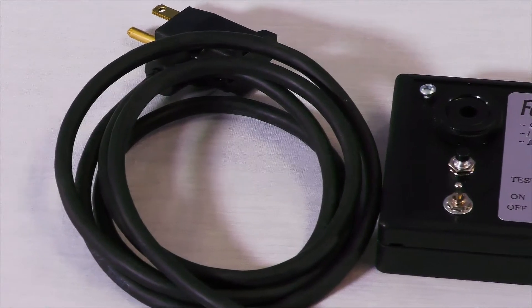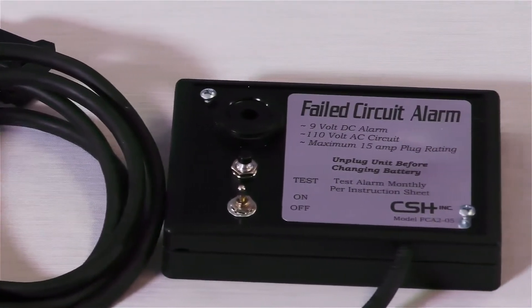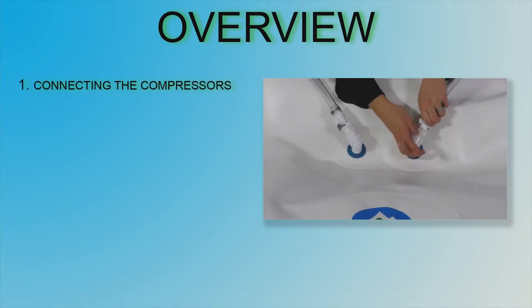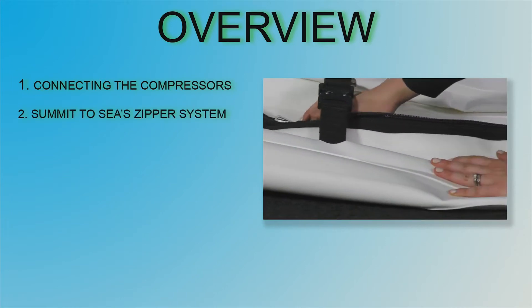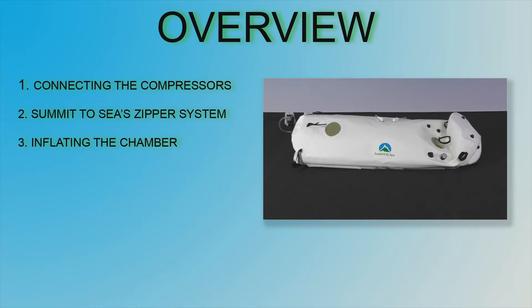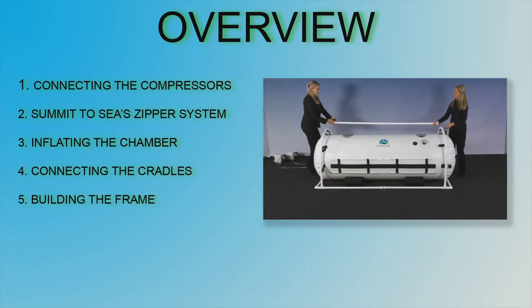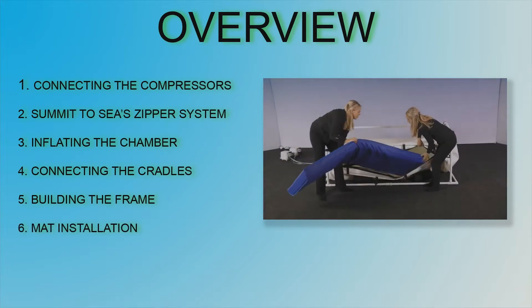The failed circuit alarm is to alert you in the event of a power outage. To give you an overview of the steps to install and operate your chamber, we will discuss connecting the compressors, Summit to Sea's zipper system, inflating the chamber, connecting the cradles, building the frame, and mat installation.